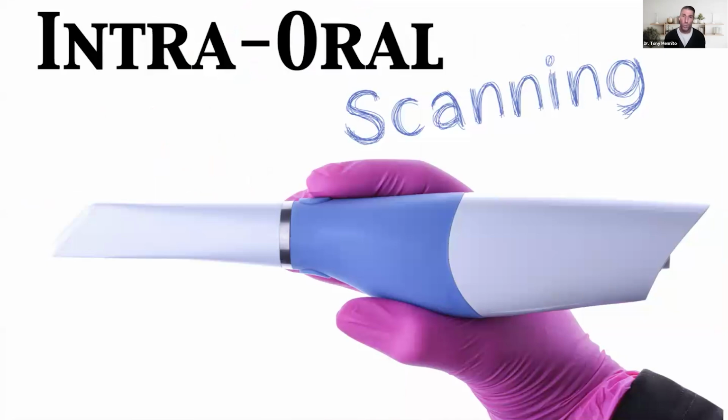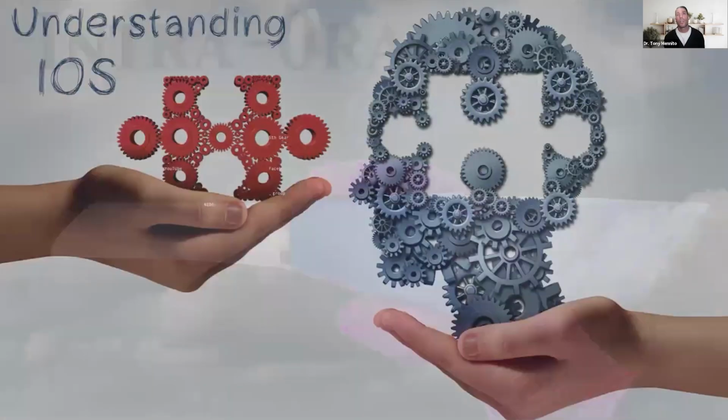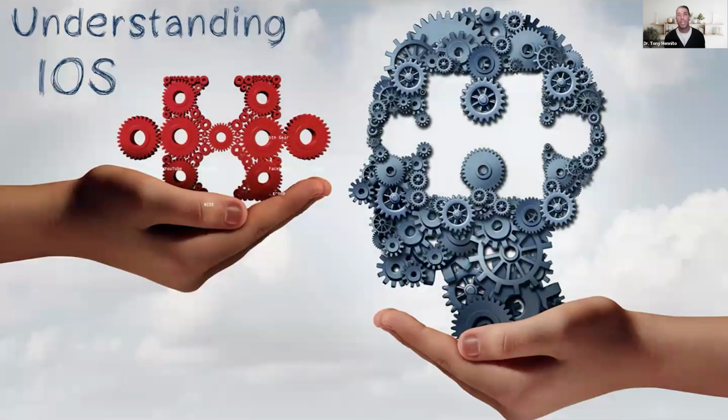I think the adoption rate of intraoral scanning is now over 50%, which is fantastic. But the idea of intraoral scanning is you're creating a three-dimensional file essentially of a patient's dentition. In the old days when we used to pour up stone models, we had to keep those around. We no longer have to do that. We have data that we can capture and store very easily of a patient's dentition.